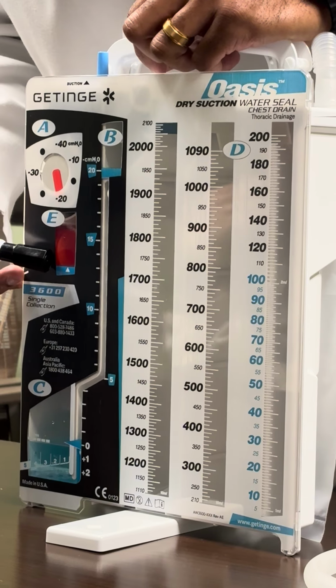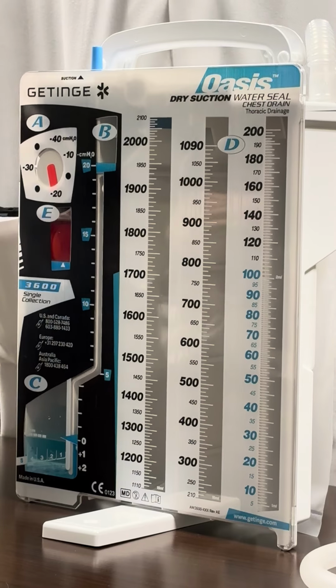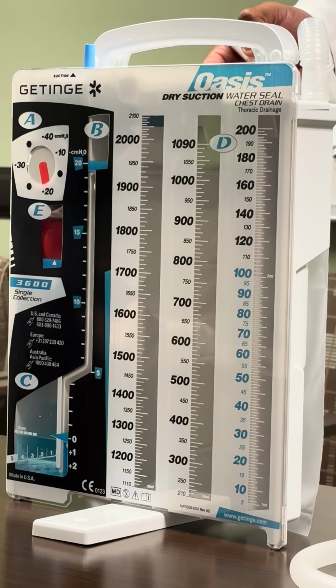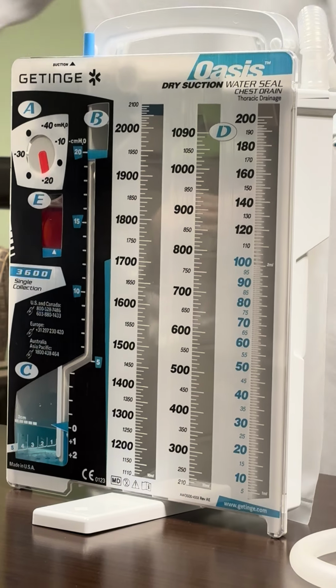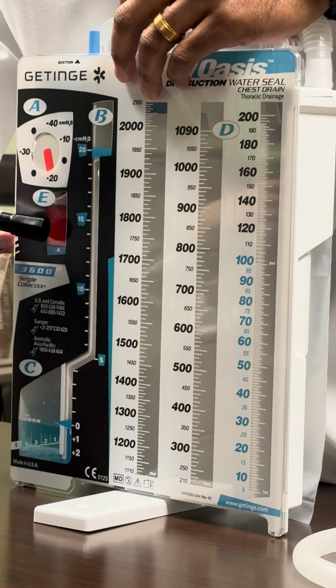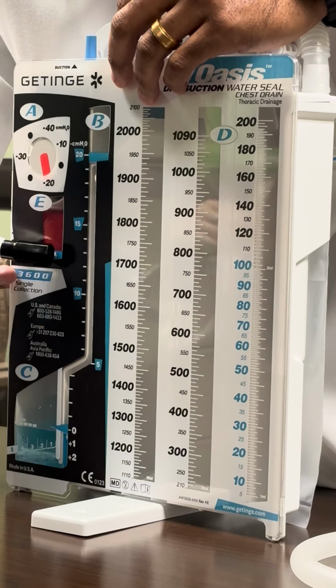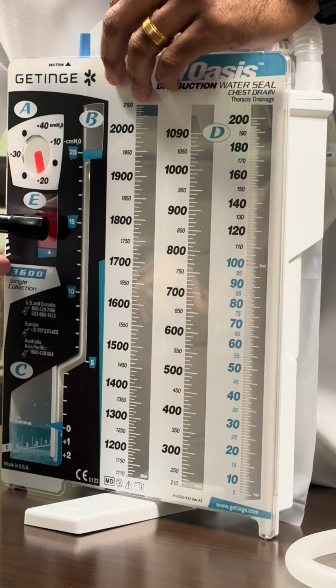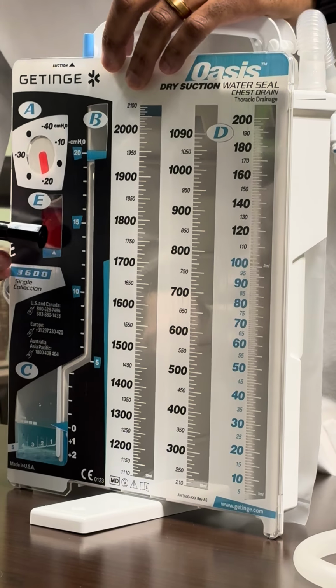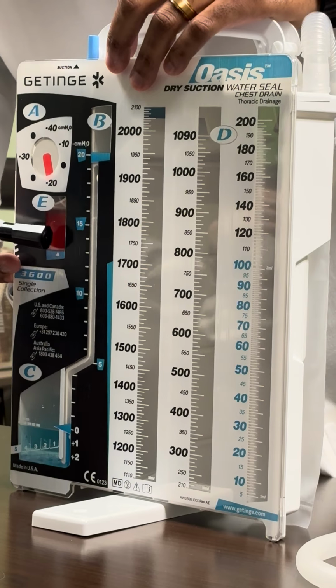If it's set at negative 20 and you have some pressure that's higher than that, again, by default, usually you set the wall suction to negative 80 to 100, you'll see this bellow come out, okay? You'll see this bellow come out and it'll hit this arrow. If you have wall suction at negative 10, you might not get that bellow all the way out there.